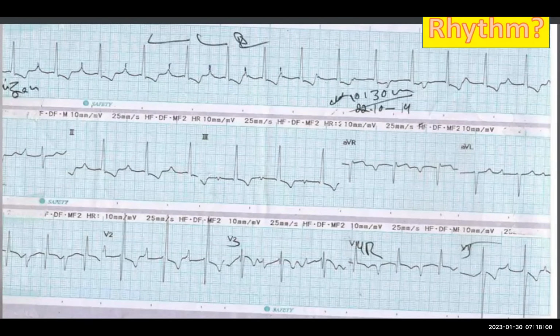So just looking at the ventricular rate, it looks to be a little less than 60. And then someone has already taken the luxury of making some dash marks for what I think are P waves. I'm seeing if that is the same, marching out at the same rate. Originally at the beginning, it's about the same rate.